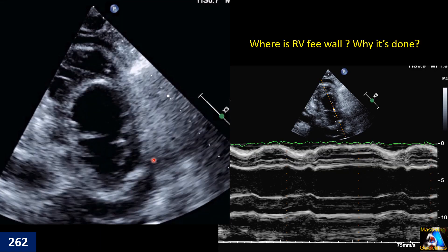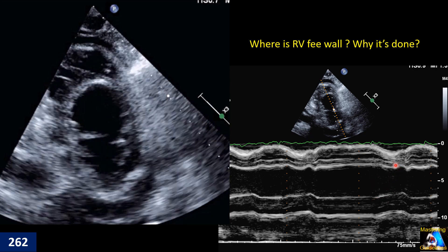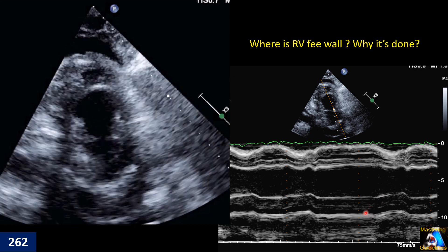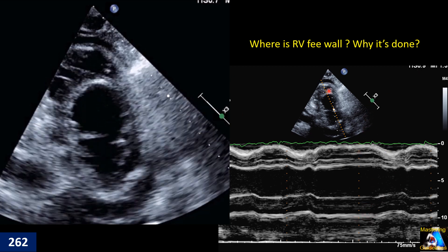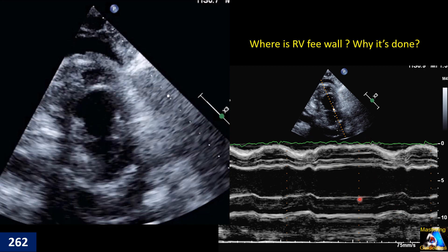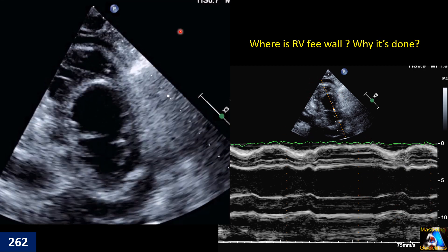Here we have another patient. You did PSAX and performed M-mode. On this M-mode, where is the pericardial effusion? Where is the right ventricular free wall? Where is the septum? And where is the posterior pericardial effusion? Those two spots you can see on 2D — where are those structures on the M-mode?